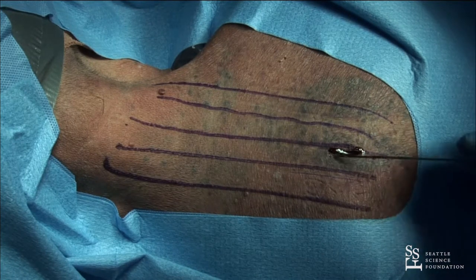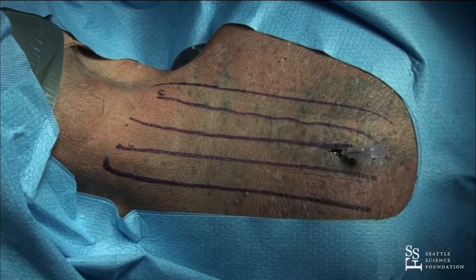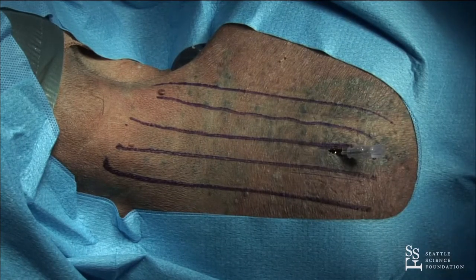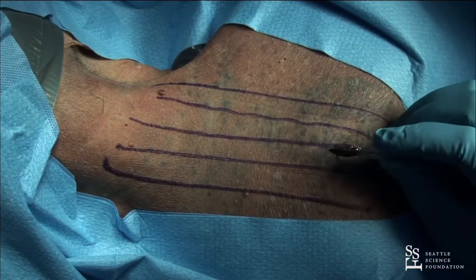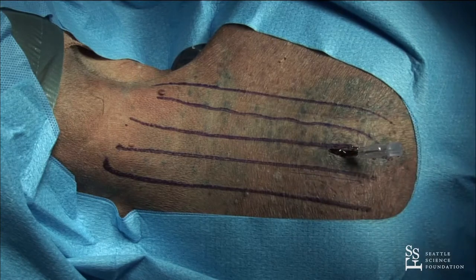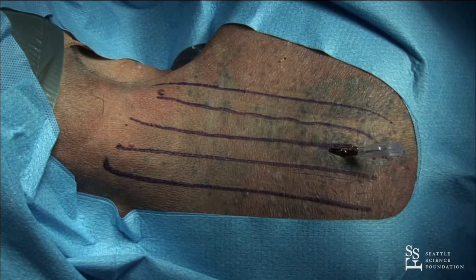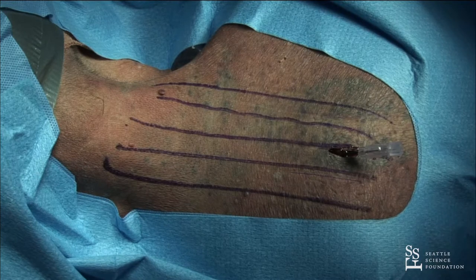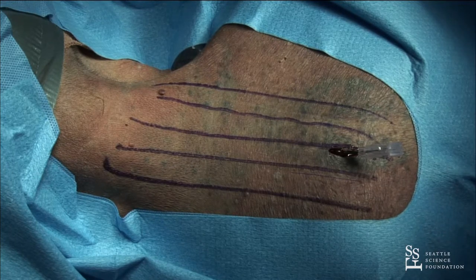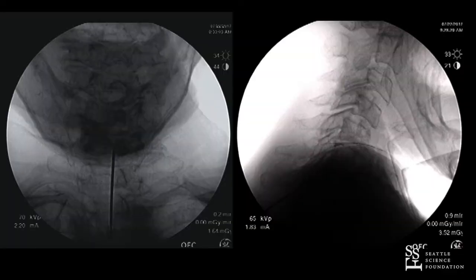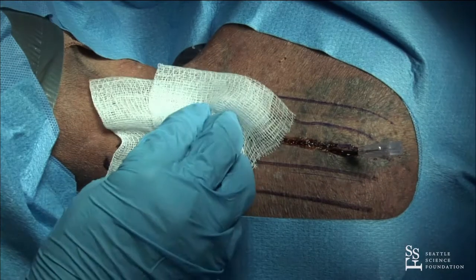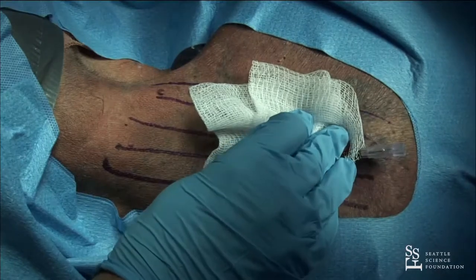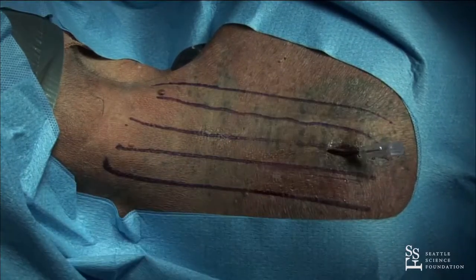And then I can just take a shot on the lateral to check — no need to do this necessarily. So Bruce, are you making a midline incision? No, I usually make two small incisions right off midline. Whether you make two incisions or three, if you're not stripping the muscles and tissues off the dorsal spine, the patient still goes home that day or the next day. You have five lines there — one's midline, the other one's the medial border of the lateral mass, and the other one's the lateral. That's correct — midline, then medial border and the medial-lateral border of the facet.